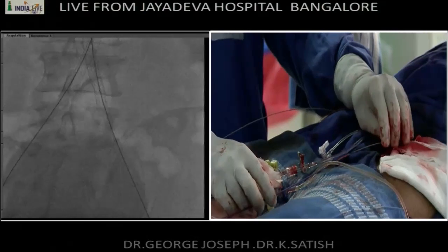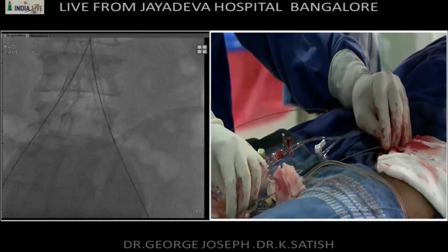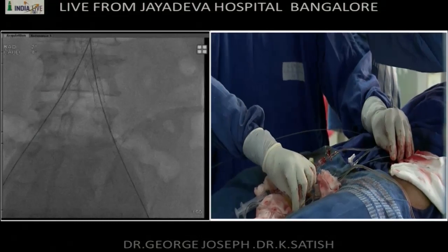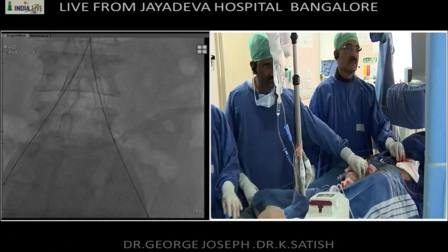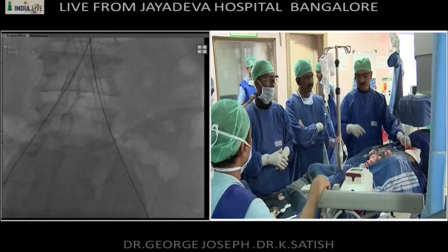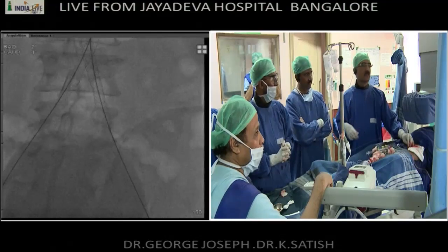No. This is a 6 millimeter post-dilatation balloon. No, the stent is bigger. What is the stent size? Both the stents are 8 millimeter in size. Self-expanding is 880? 8 millimeter. Yes, yes. The balloon expandable on top was an 859 and the self-expanding is an 880. That's okay. Sorry, we didn't register.